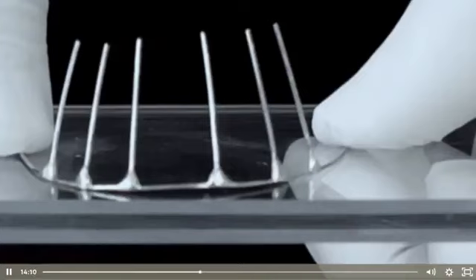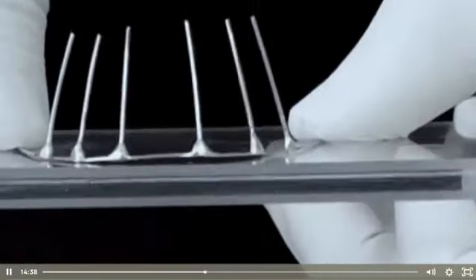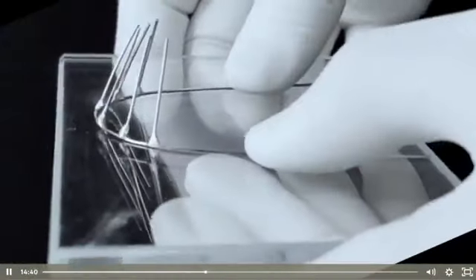When I do this torsion in this arch, using the wagon wheel effect, for each 4 degrees of torque in the anterior segment, I'm giving those anterior teeth 1 degree of angulation of the roots towards the center. So this is the way that I'm really applying the torque.